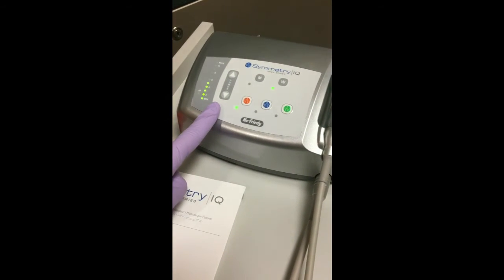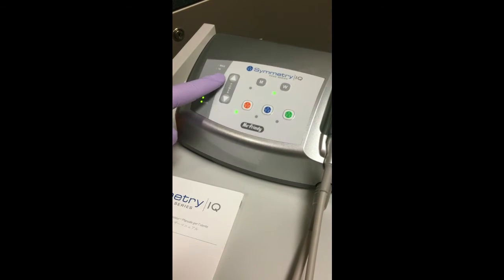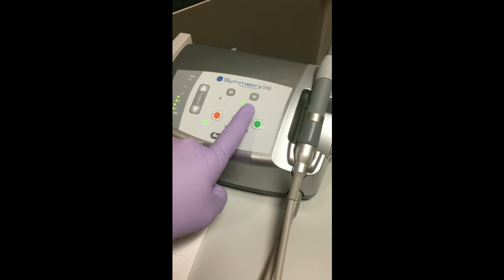The power of the tip can be adjusted with these buttons right here — increase and decrease. This is the water button to maintain water flow through the unit.